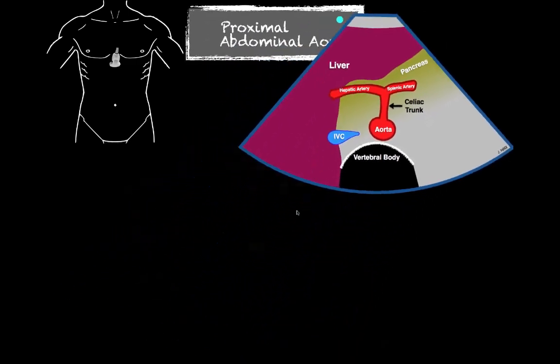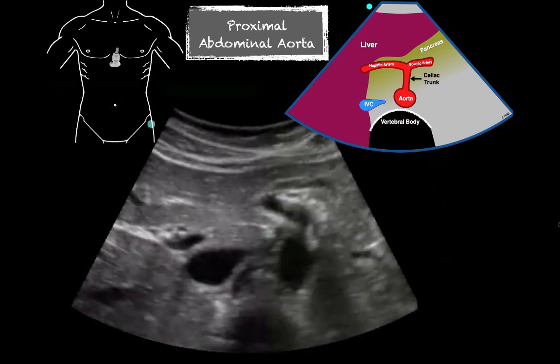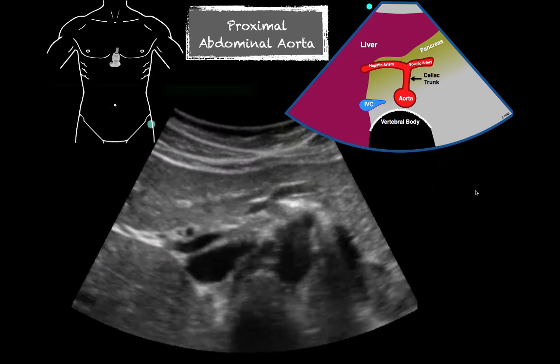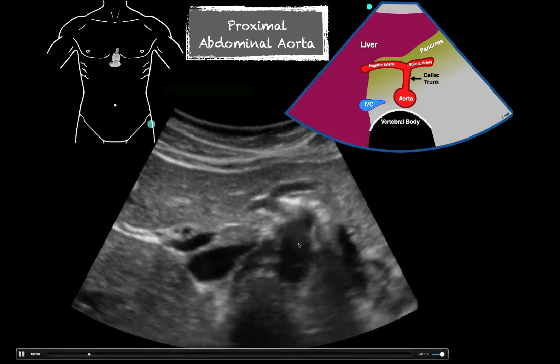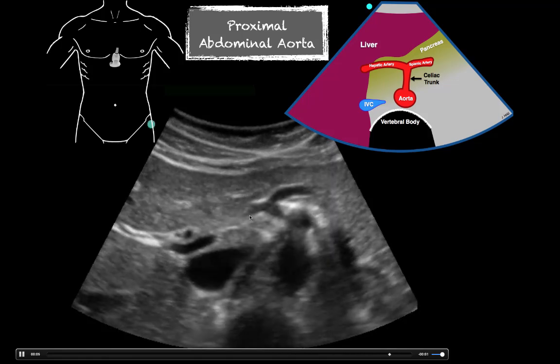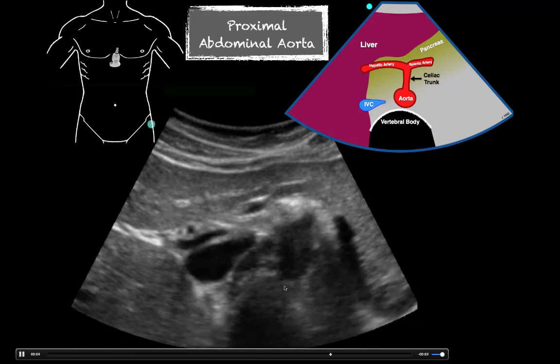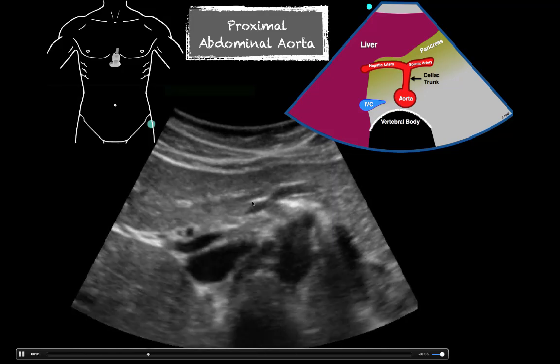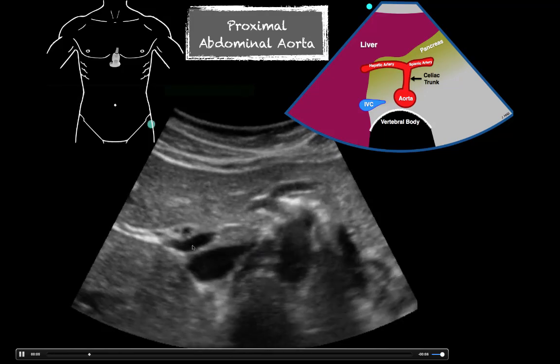Here in the live image we can see that seagull sign. Here's our aorta, and the celiac trunk is coming up — here's our splenic artery going this way and our hepatic artery here. Here's our vertebral body. We don't quite see the hyperechoic line but we can tell it's there. Here's our IVC, and this is going to be our splenic vein coming across — we'll talk about that more on the next clip.